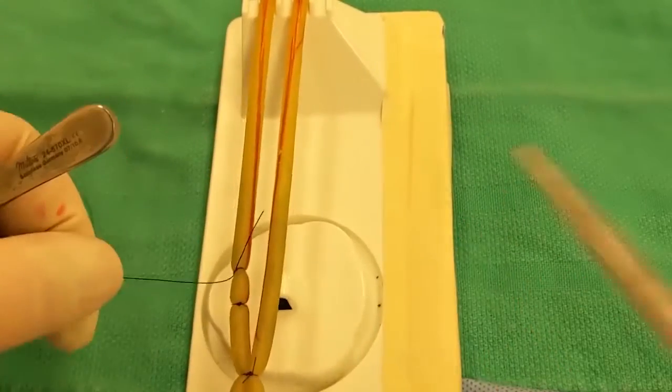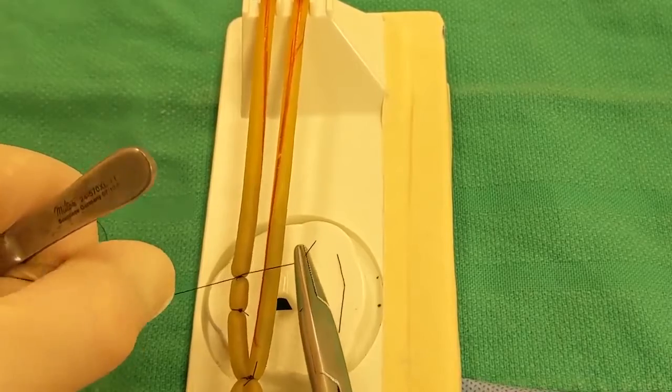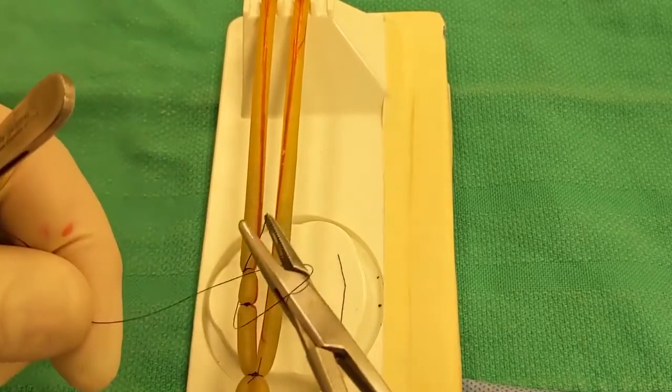If your suture ever breaks when tightening a knot, you should always re-tighten that throw before your next throw, because the throw can loosen up when the suture breaks.